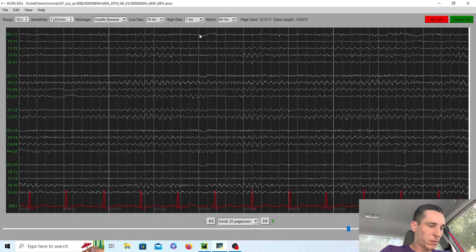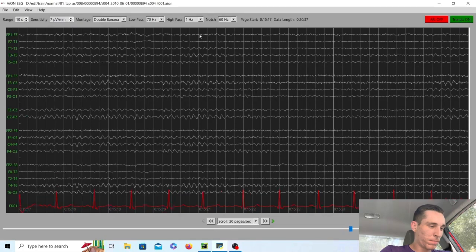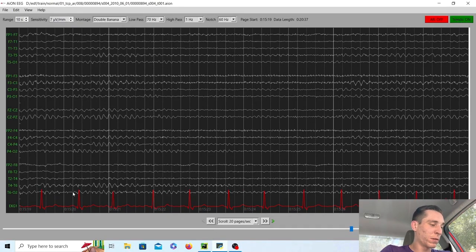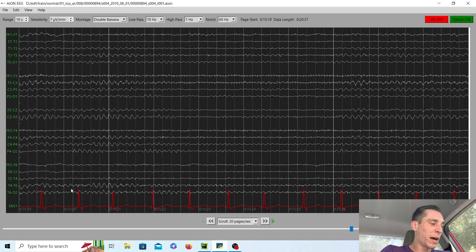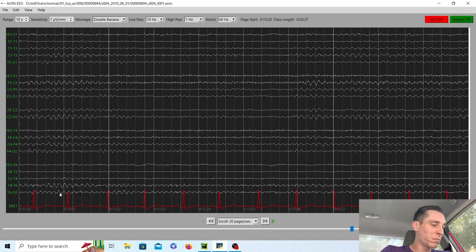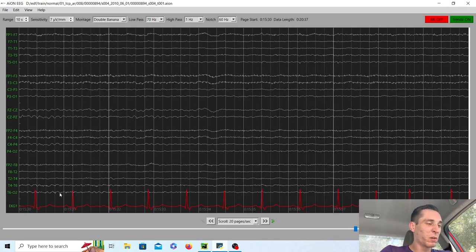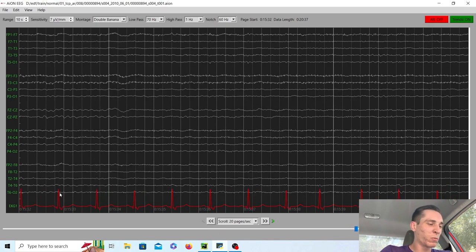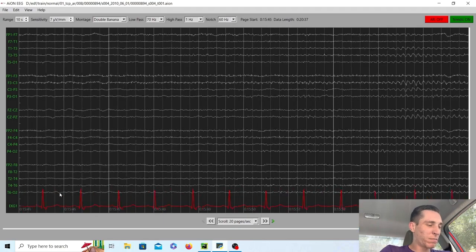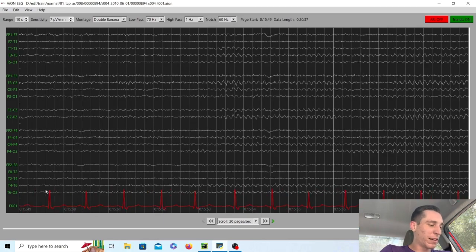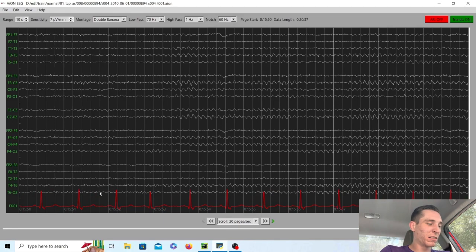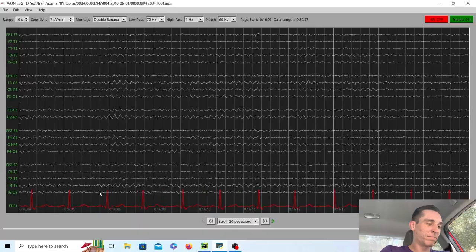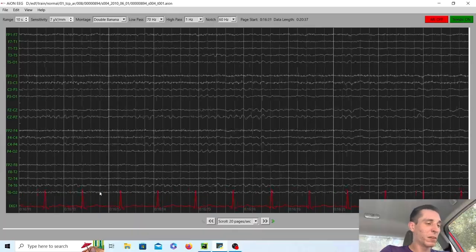As we scroll through, some of the nine waves per second awake background may be coming back because they're a little bit more awake. They're more aroused, but you know, it's waxing and waning. So they're definitely still very sleepy person.